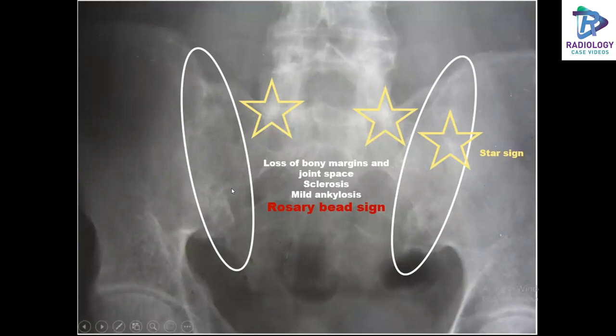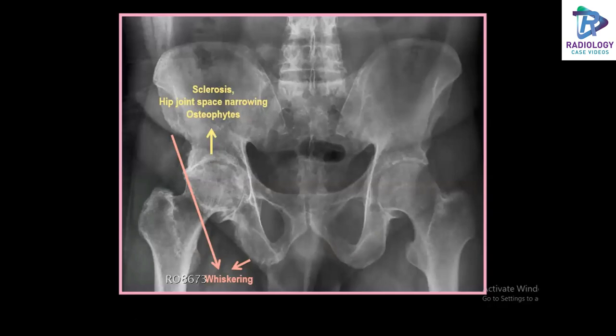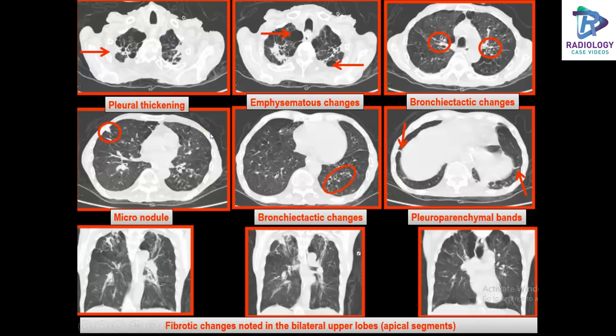A frontal radiograph of the pelvis shows sclerosis, hip joint space narrowing, and osteophytes with whiskering in the right hemipelvis — findings seen in ankylosing spondylitis. Findings in the respiratory system in a patient with AS include pleural thickening, emphysematous changes with bullae, bronchiectatic changes, micronodules, pleuroparenchymal bands, and fibrotic changes in the bilateral upper lobes, predominantly in the apex.